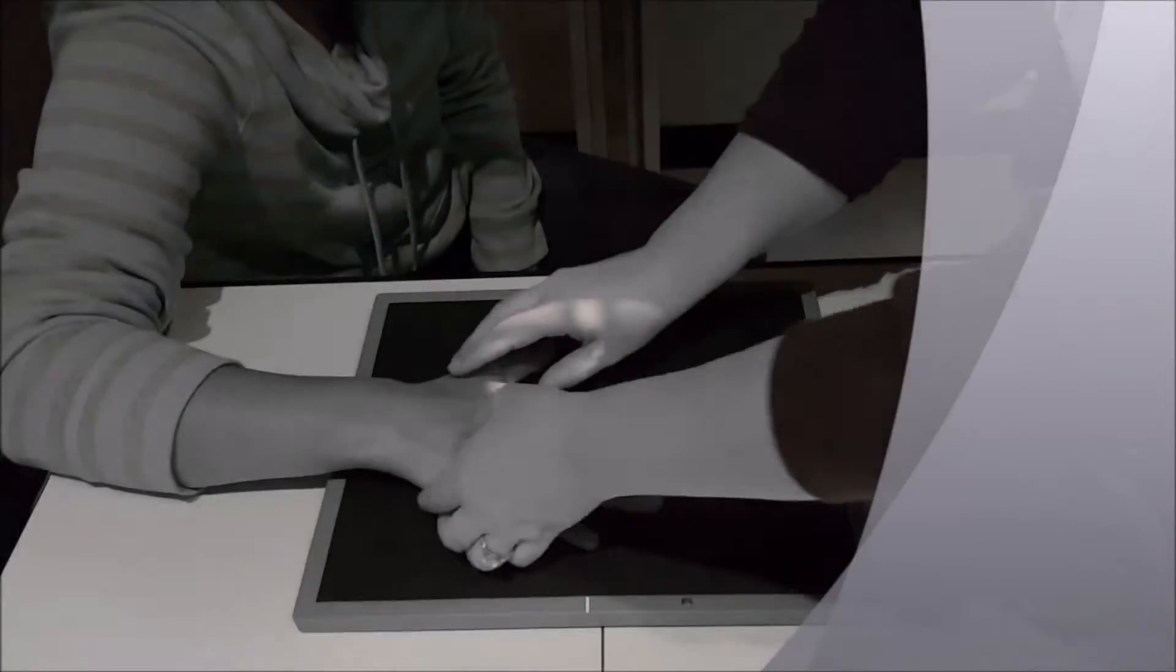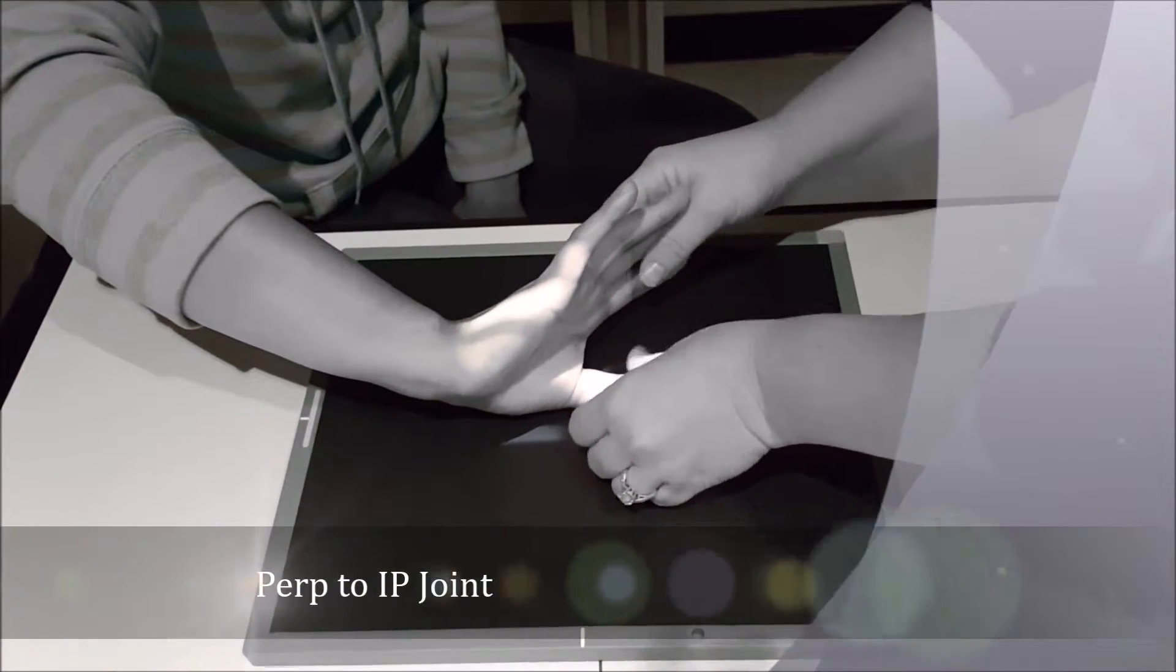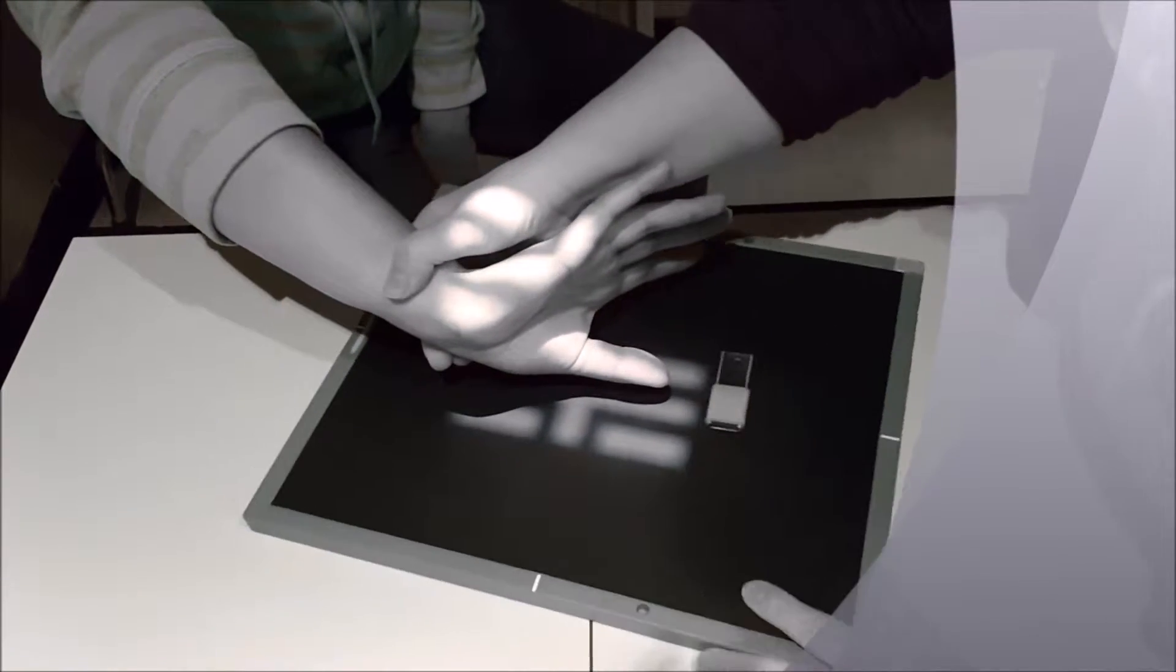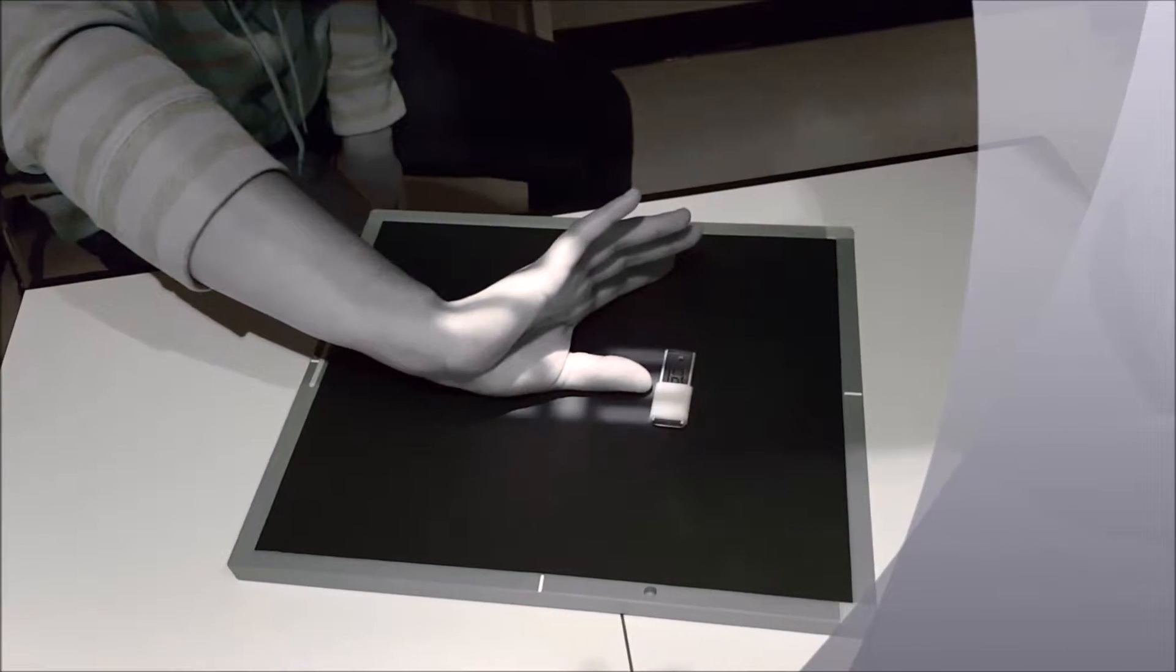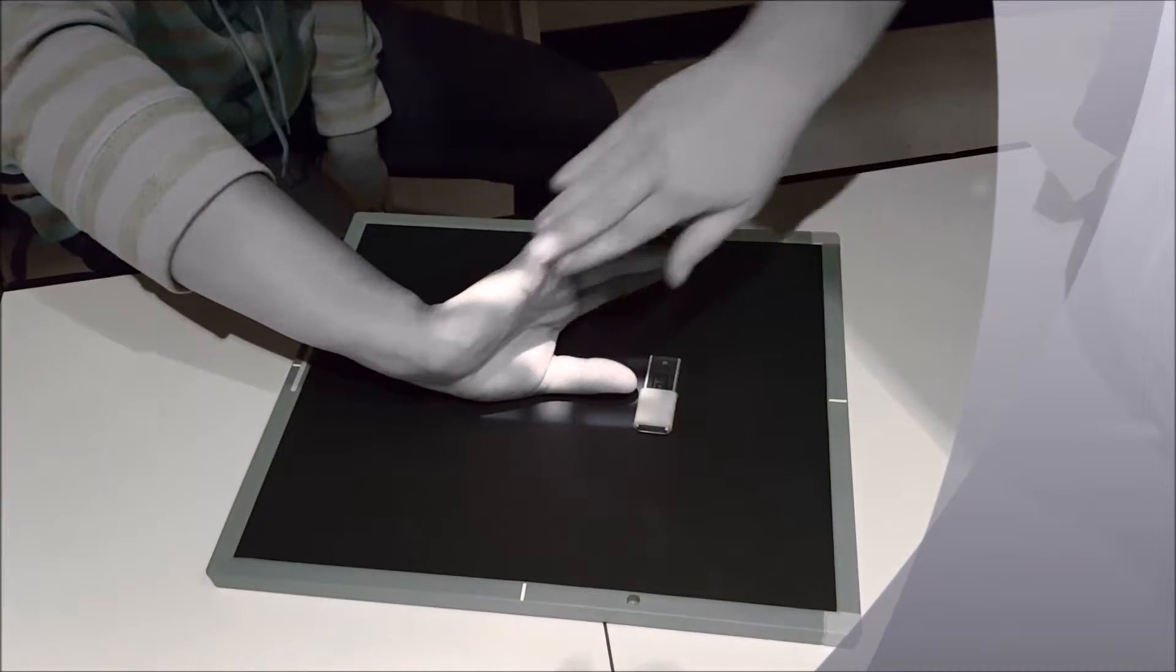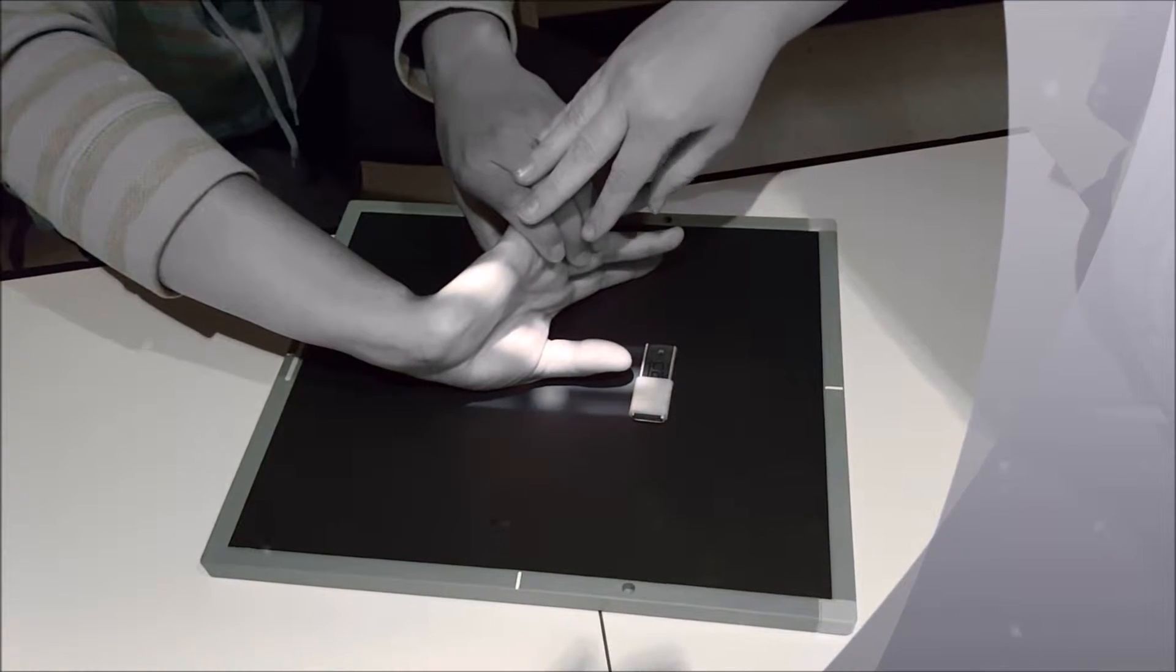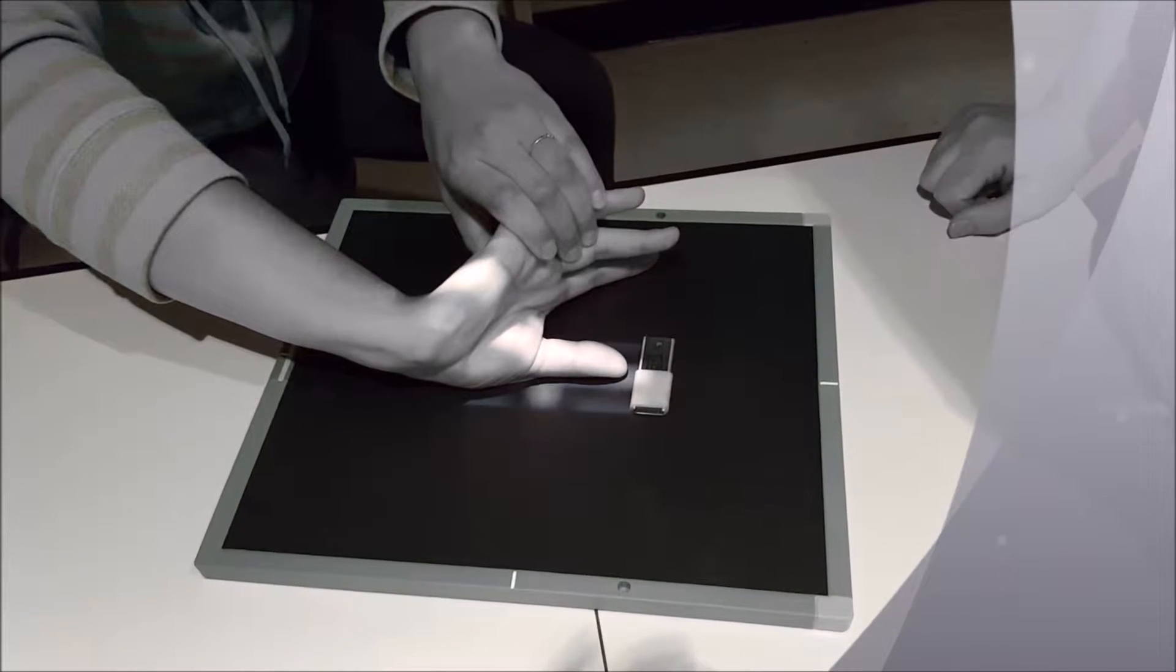Thumb projection, so we're going to have our patient turn their hand around and there is no PIP joint so we're going to be at the interphalangeal joint of the thumb. I'm going to kind of turn everything so it's all in the same plane here. It's kind of easy for the rest of the hand to get in the way, so if you have your patient hold their digits out of the way, you'll get a better projection. So you can see here that this is an AP projection of the thumb.